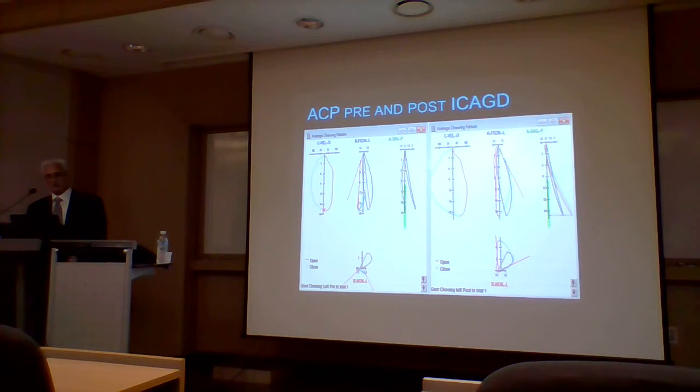This is 16 millimeters tall. This is 20 millimeters tall. Much broader chewing stroke. 추잉 스트로크를 봤을 때 옛날보다 훨씬 더 옆으로 넓어지고 아래로도 편하게 이제 버티컬링이 들어올 수가 있고. And then in the frontal view, where they were chewing on the right side of their head instead of chewing on the left side of their head. After treatment, you can see they're chewing, the blue is inside the ellipse, just a little bit outside what is normal, but now they're chewing on the left side of their head.